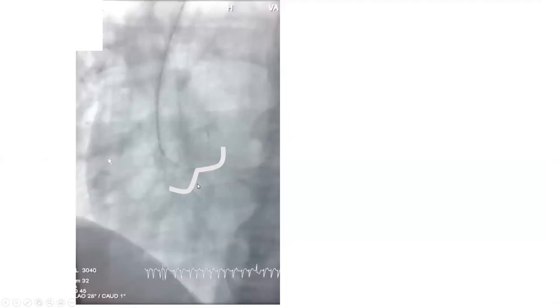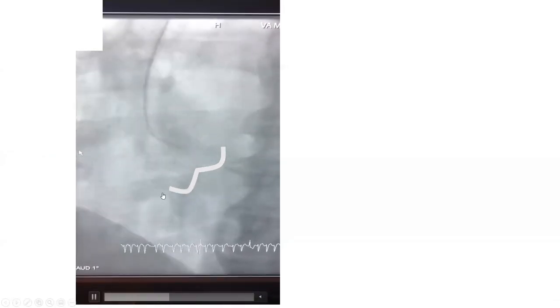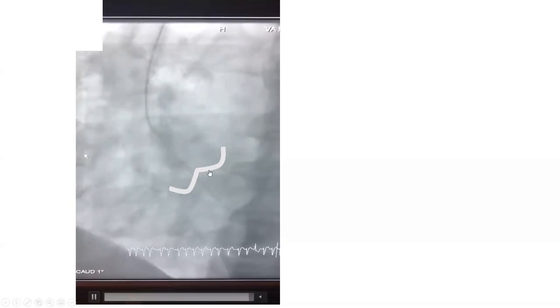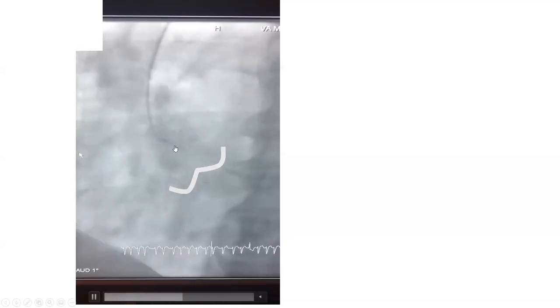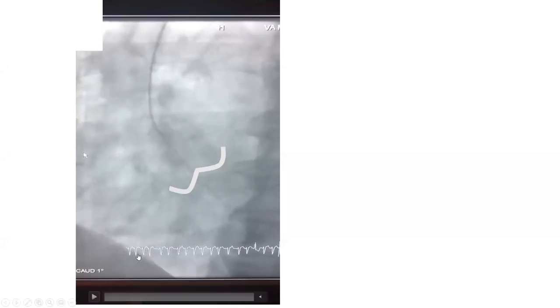Here's another illustration: initially in the right cusp — the wire tells us we're in the right cusp. The looping at the right cusp showed the fellow where he was — he pulled a little bit, then advanced the wire and it went right into the left ventricle, then advanced the catheter over it.